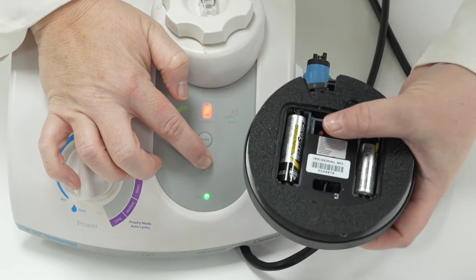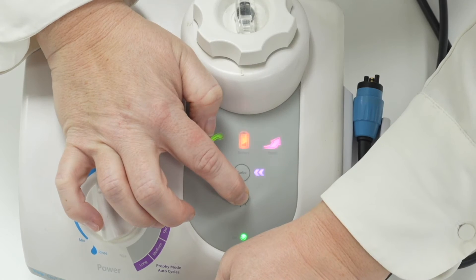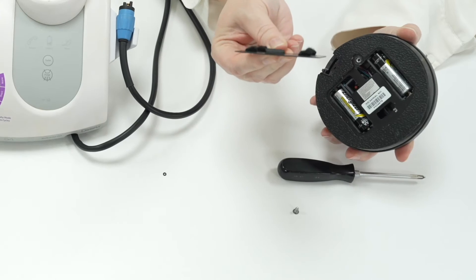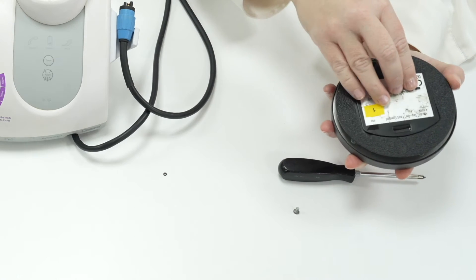Then press the small red button on the base foot pedal which is found in between the batteries until all the icons on the Cavitron panel are flashing at the same time in unison. Once that has happened the foot plate can be replaced.